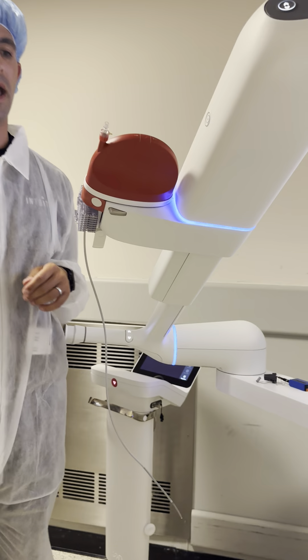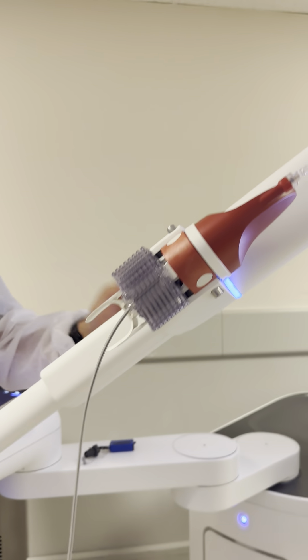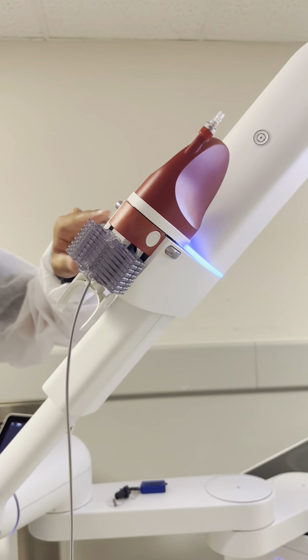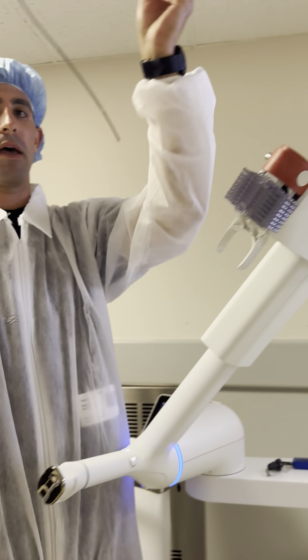So now we're at step two to remove the catheter. These gray buttons on the catheter on the sides right here — we're going to press both of them. It's going to pop out and we're just going to pull it out like that.